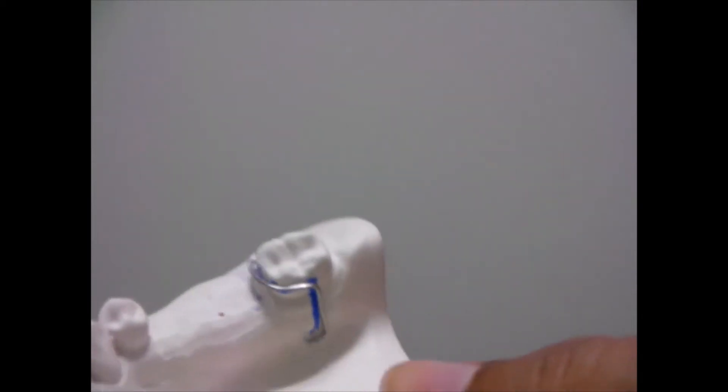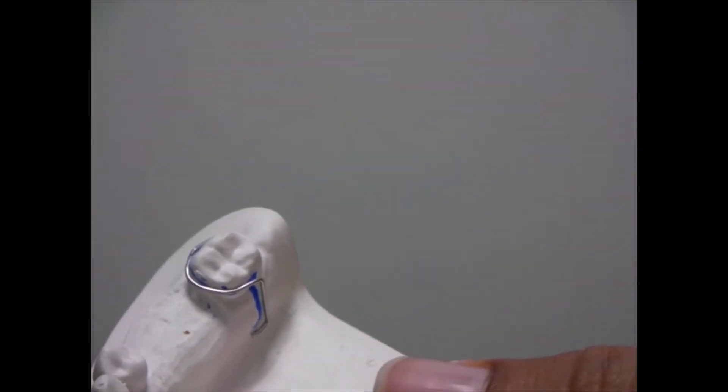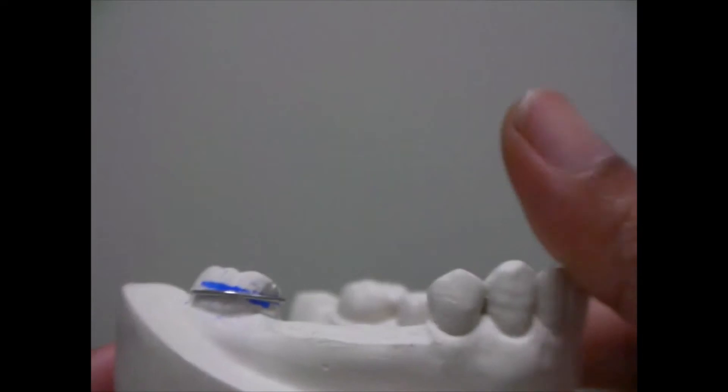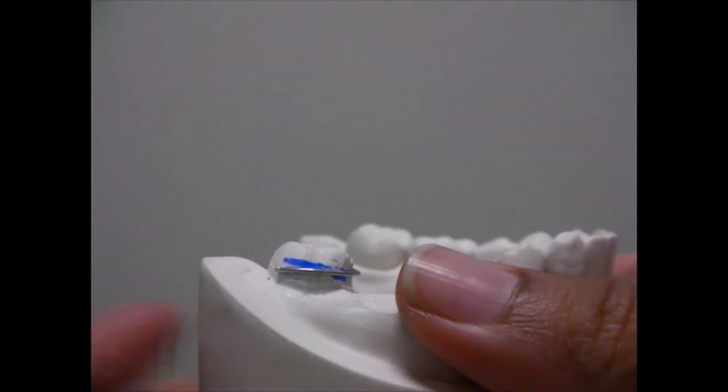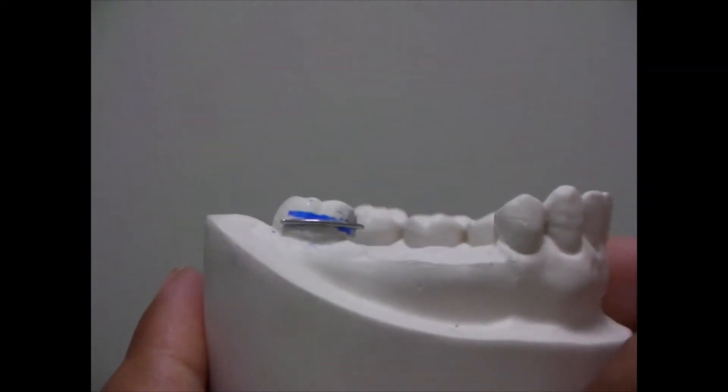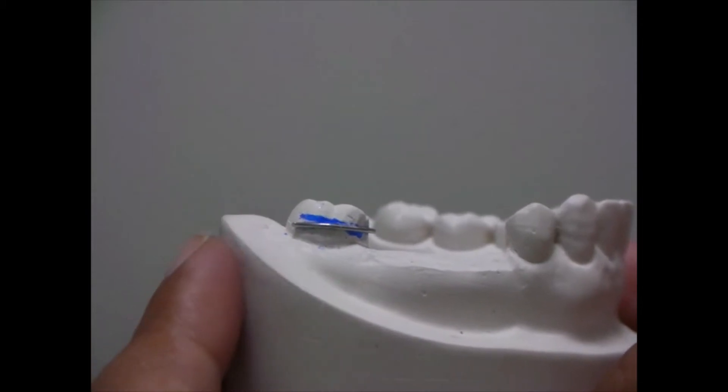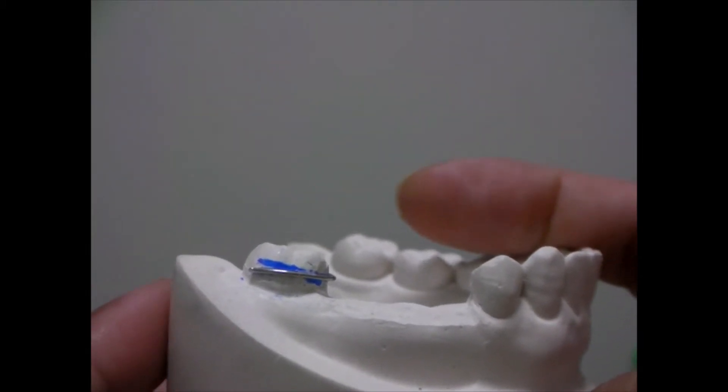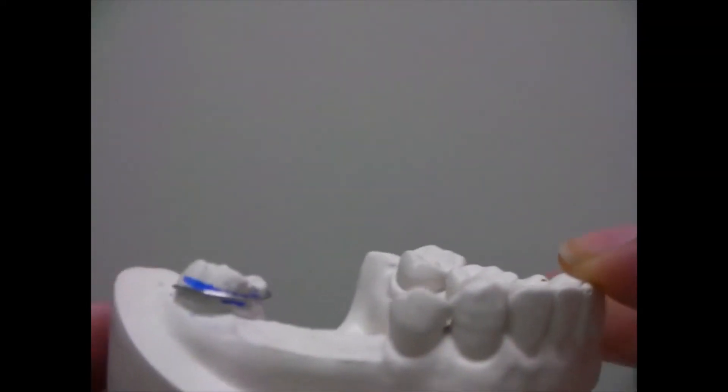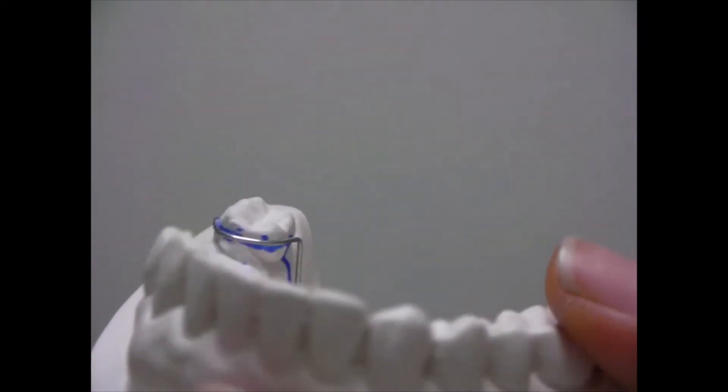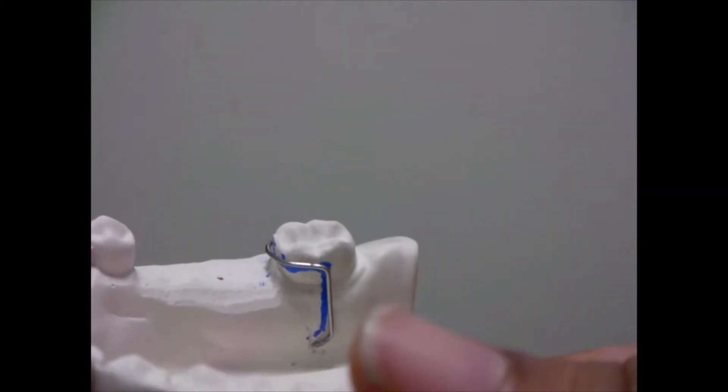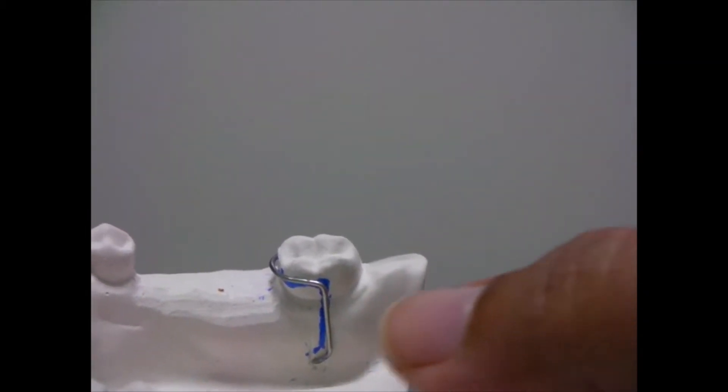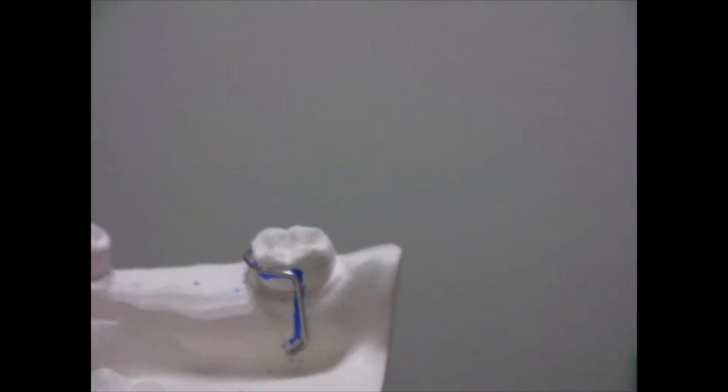So as we study the parts of this clasp you can see that here we have the active arm or the buccal arm which is actually engaging the buccal part of the tooth and this is now going to follow the circumference of the tooth to go on the lingual side and here we have the reciprocal arm.